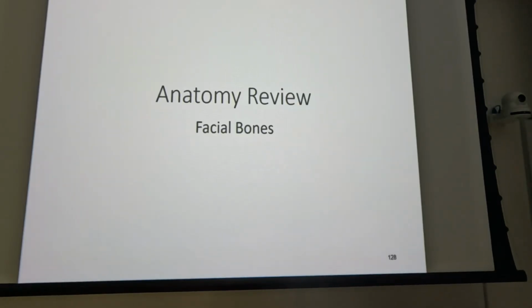And we're going to start really on page 55, even though we've got nasal bones in a different section. I'm not real sure why we do, because it's a very commonly fractured facial bone. It is a facial bone, and there is at least one question on the test on nasal bones. So we're really only going to do 2 views for nasal bones. One view is kind of a repeat. You have 2 nasal bones, so we're going to do bilateral laterals.